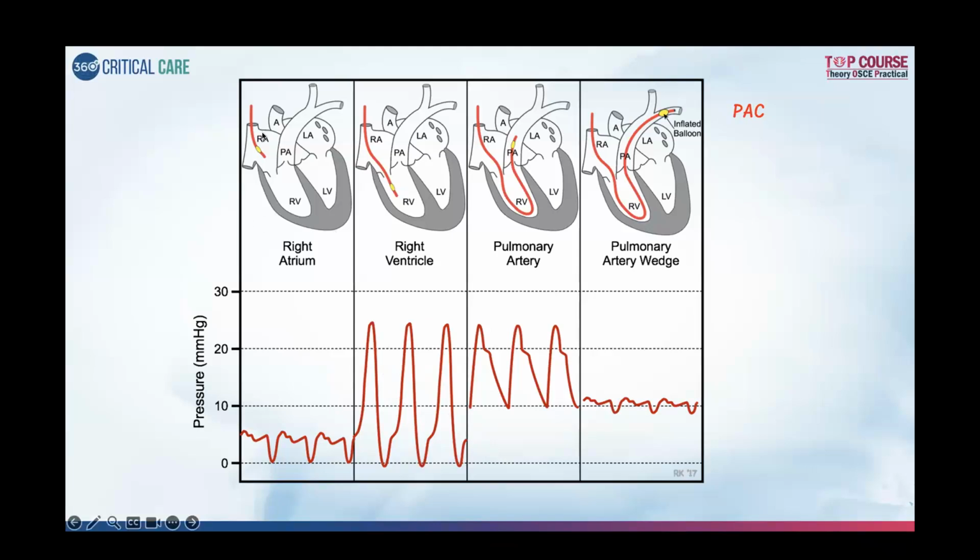While you float the pulmonary artery catheter, or initially you put the catheter inside, as you can see, into the RA, and then let the balloon inflate so that it goes through the valve along the flow of the blood into the right ventricle and then into the PA. Initially, the pressure that you see in the right atrium is a usual CVP waveform with C, V, A, Y, and X components. So usual CVP waveform, as you can see. But when the balloon reaches the RV, that's where you will get a systolic and a diastolic pressure.